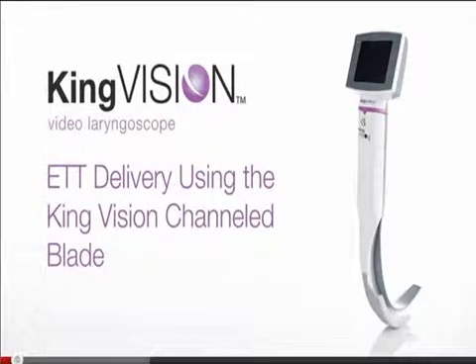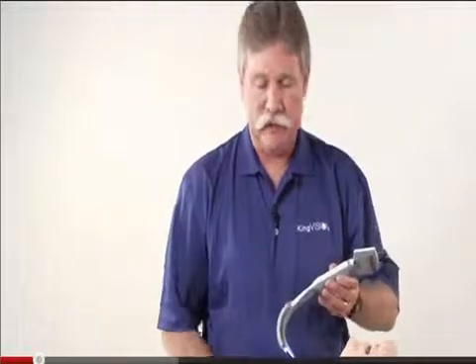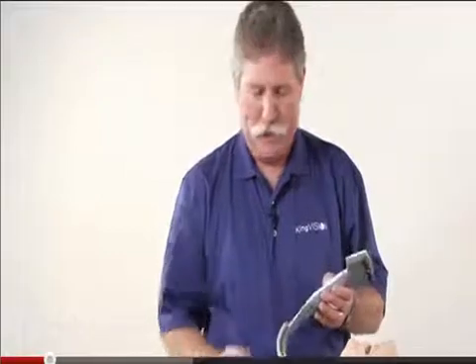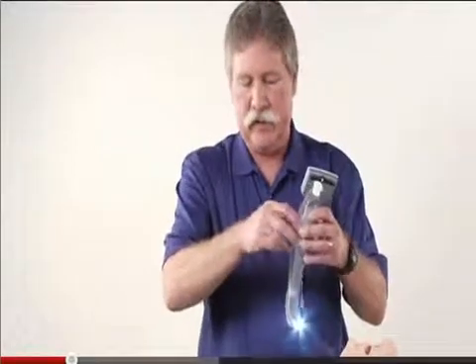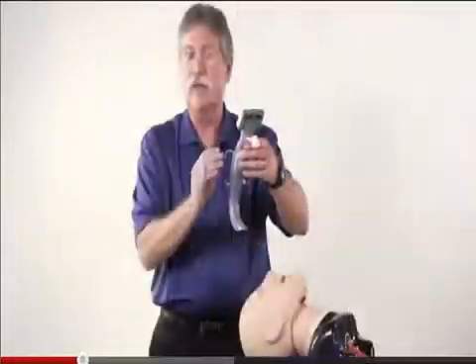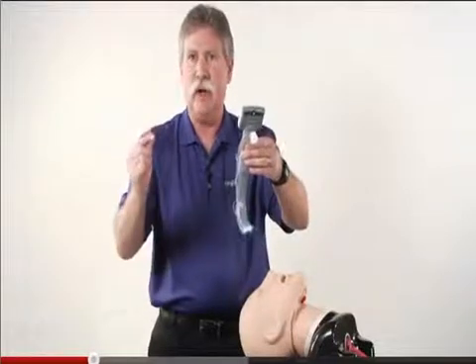Some key aspects associated with the channel blade for the King Vision video laryngoscope. This has an 18mm mouth opening requirement, and because of the channel, no stylet is required. The channel does allow standard tracheal tubes from 6 to 8mm, and it's important to note that you are manipulating where the tube goes with the blade itself, as opposed to freehand with your right hand.